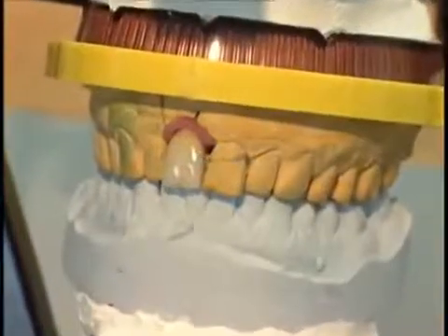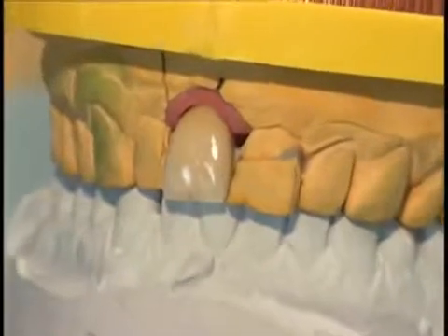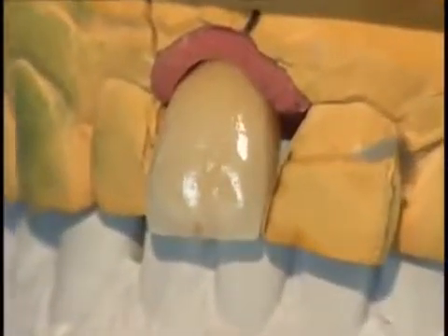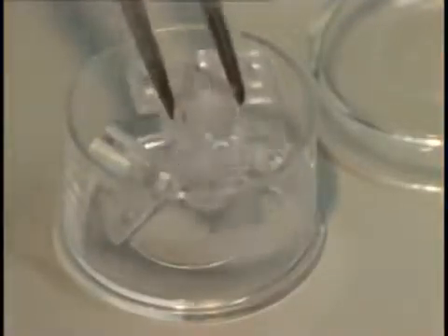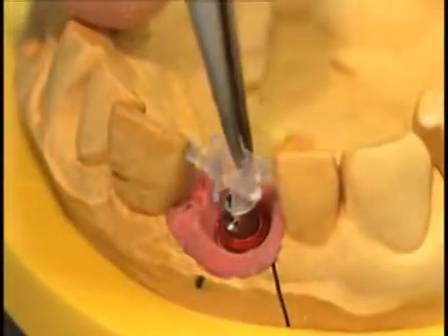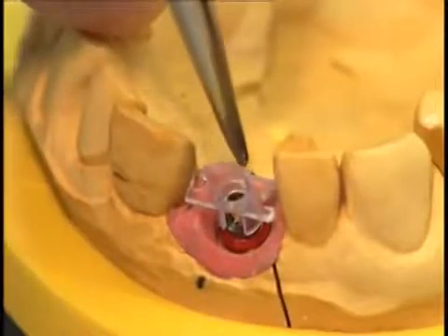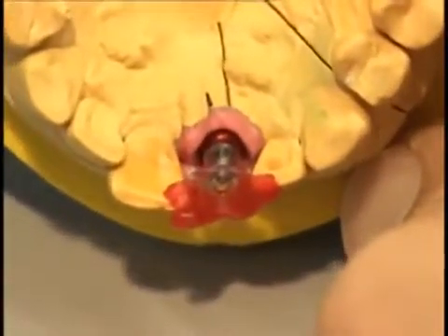To ensure a correct transfer of the position of the RN Synocta transversal abutment from the working cast to the patient in the dental office, a prefabricated transfer aid can be used. It's made of plastic, can be attached by polymerization, and is simply slid onto the RN Synocta transversal abutment. A transfer index is created on the working cast in order to transfer the abutment to its precise position on the implant in the mouth.